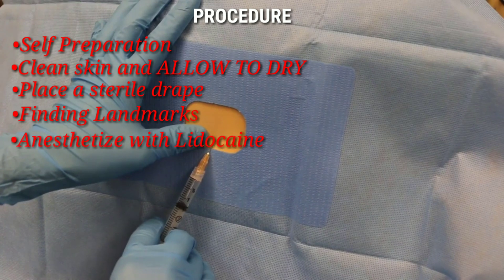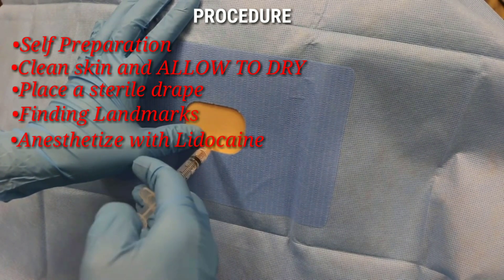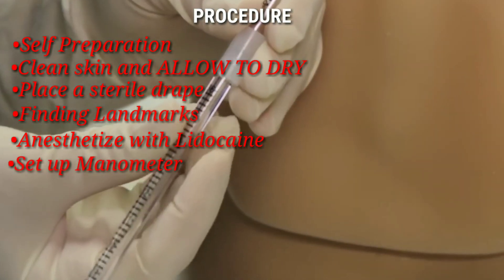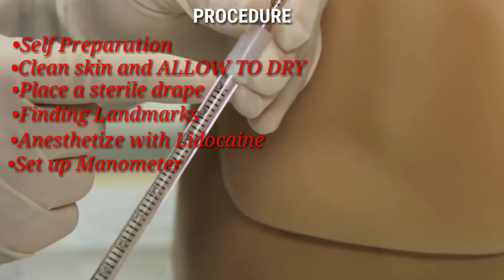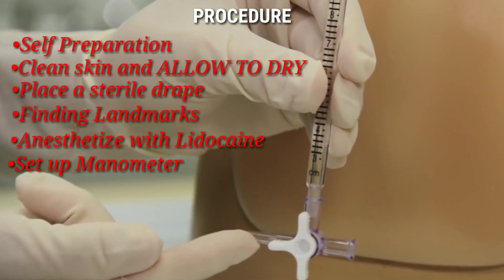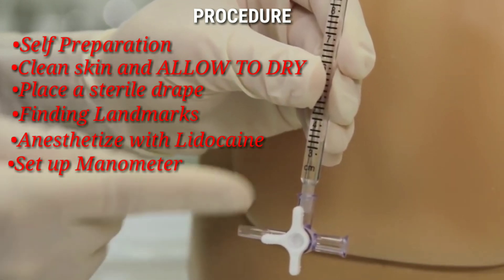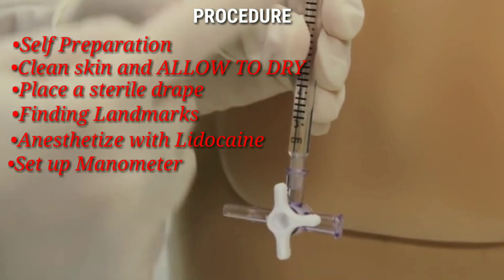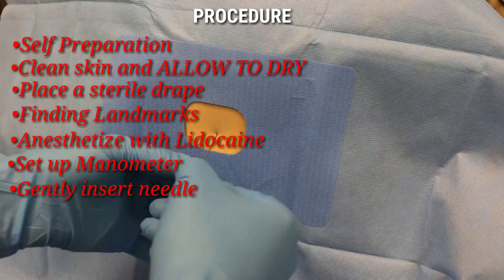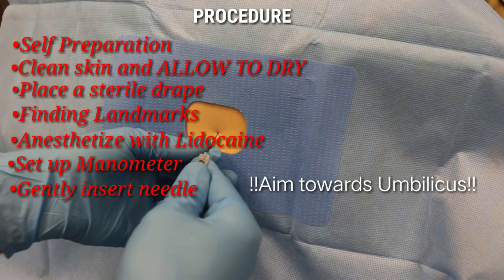Before going in, use lidocaine for local anesthesia. Keep your tubes ready and keep the manometer in place to measure the opening and closing pressure. Connect two pieces of tubing to measure pressures above 30 centimeters of water, then connect a three-way stopcock at the base where the spinal needle will connect. Make sure both the spinal needle end and the manometer end are open. Begin advancing the needle slowly, staying midline and aiming toward the umbilicus.